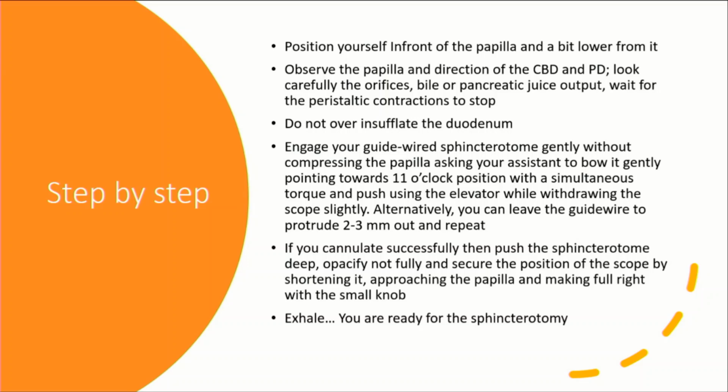Essentially, this is a move that requires very good coordination between the nurse and the doctor. Alternatively, another technique sometimes is that you can leave a few millimeters of the guide wire protruding outside, and you can do the same maneuver more or less.